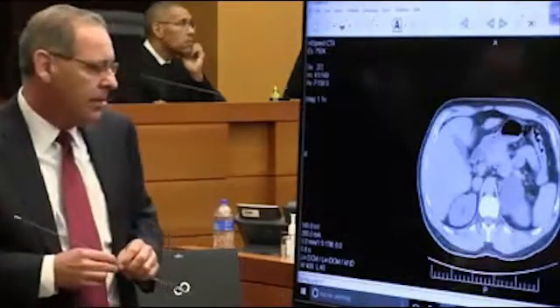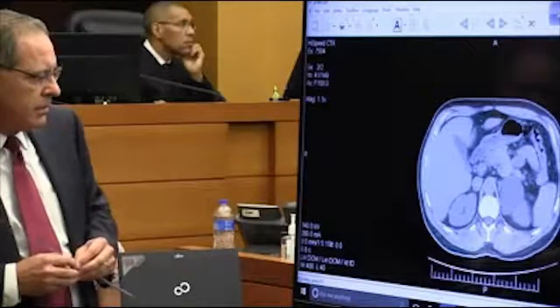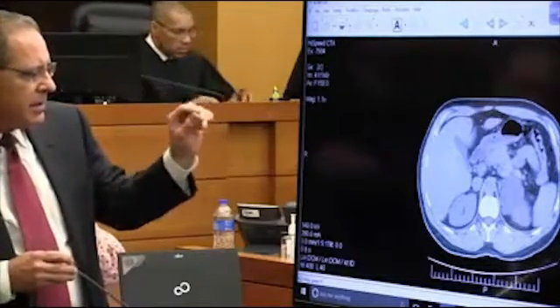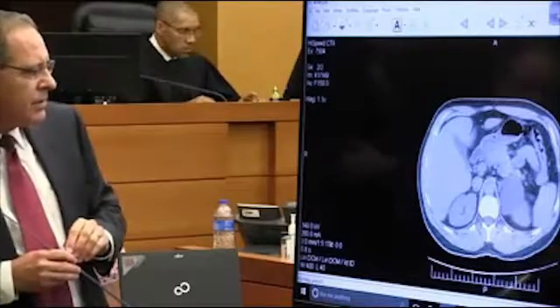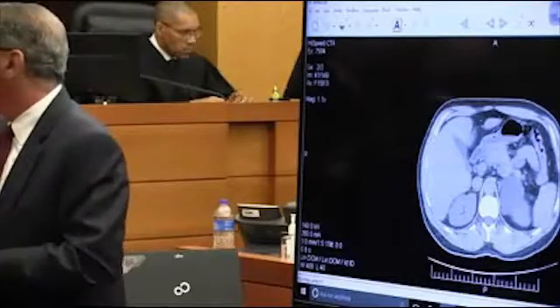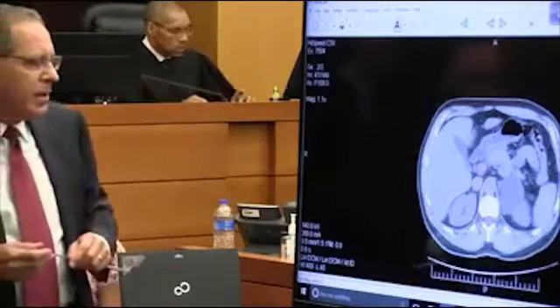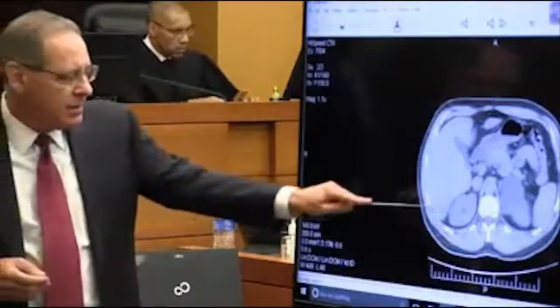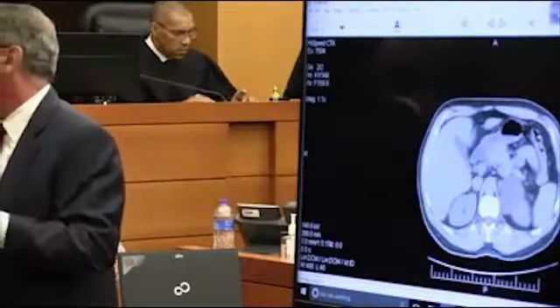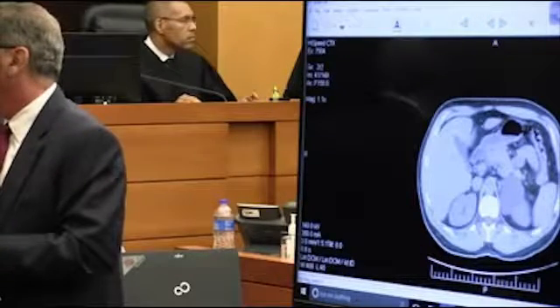For you as the urologist stepping into the radiological realm, do you see something that needs a follow-up contrast CT scan for assessment? If I were viewing this CT scan in my office in a patient who presented with a kidney stone in a clear clinical situation, I would not pursue anything different at all. Would you use the word lobulation to describe that necessarily? I would not. It looks to me like a rounded structure coming off. It is described as a lobulation in the report, correct? It is. And I think Dr. Hill might agree that it's a lobulation.